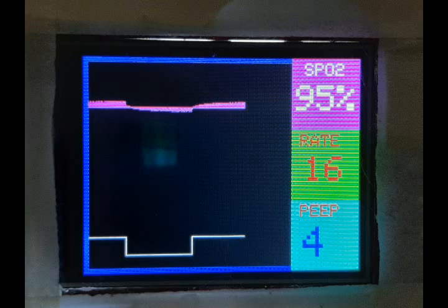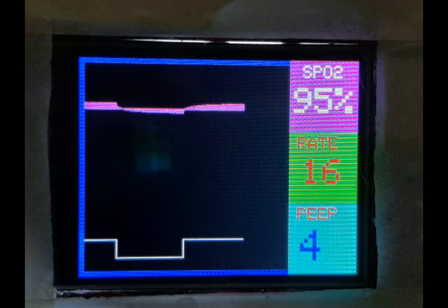So these are the general ventilator modes. There are many other operational modes available, but normally these two modes are commonly used on any kind of basic ventilator. These two types of pressure mode are in common use, so I am also using these two types of pressure here.